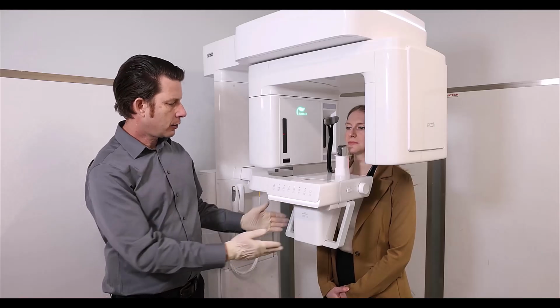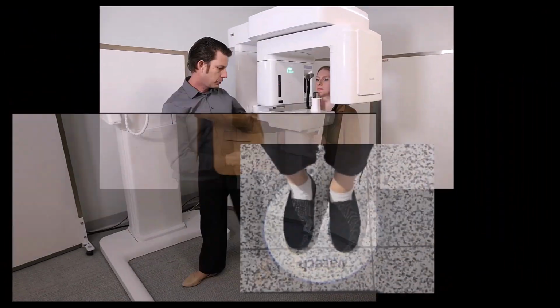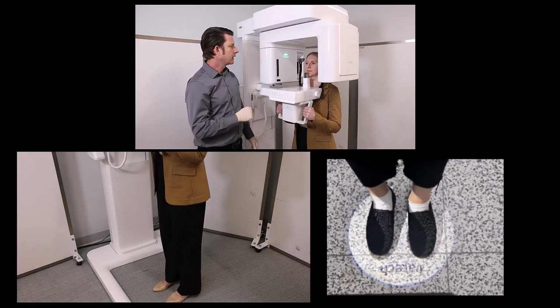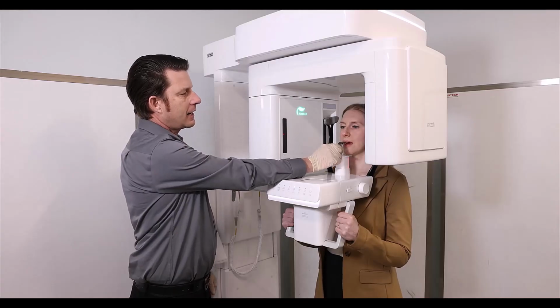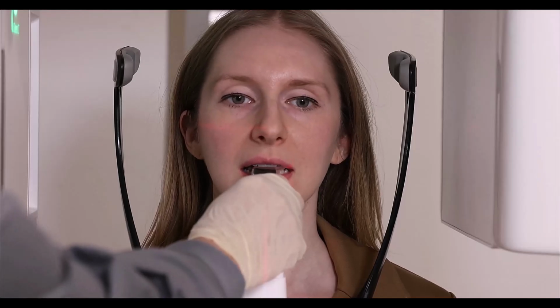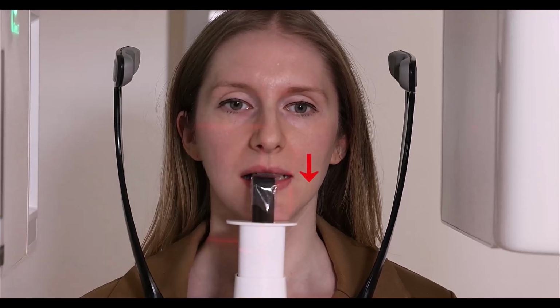So first thing, let's go ahead and hold with your hands on the handrests. Go ahead and walk forward, and you'll put your feet in the footprints. And I'm going to guide them into the device. Go ahead and open and gently close on the bite stick. And I want to make sure their anterior teeth are in that groove. And I'm going to gently push down on the bite stick.